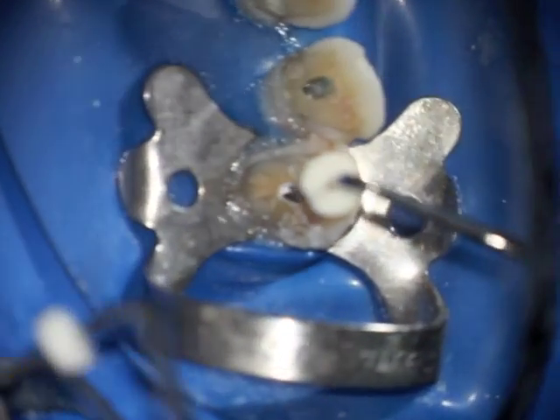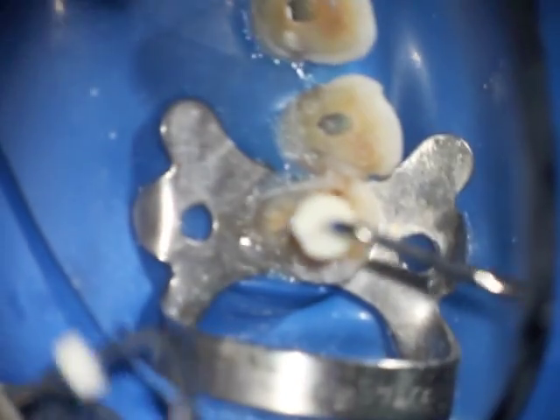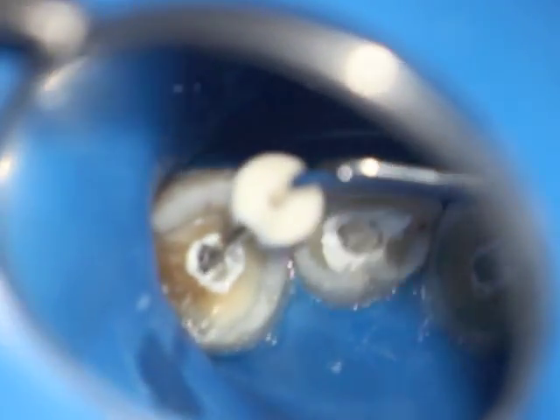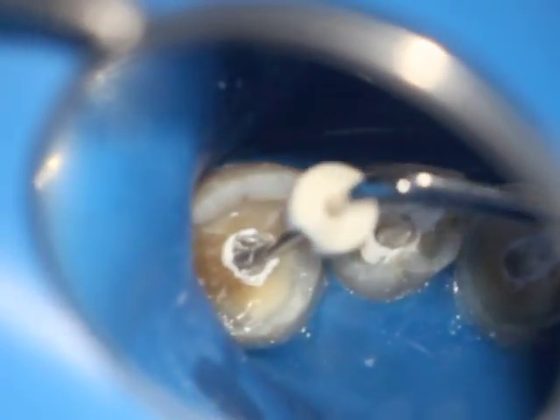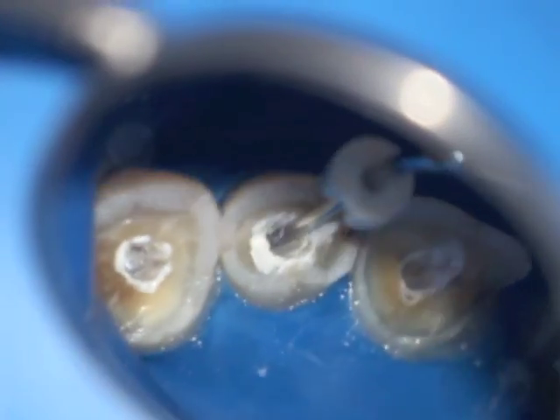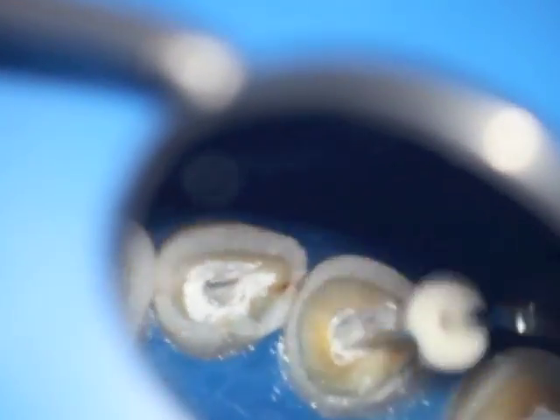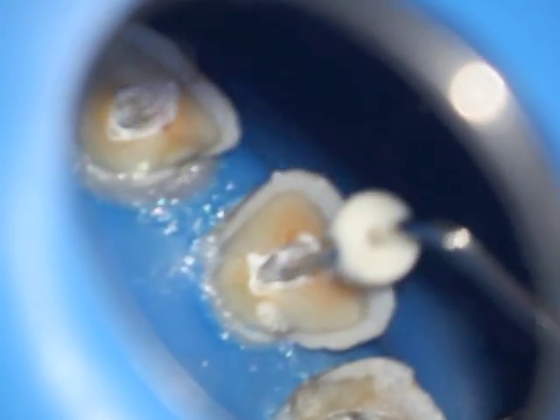This is really a byproduct of the current way of fitting the EndoSequence cone into the canal, and then having the ability to have the bioceramic sealer fill in the gaps. You can see now a small condenser is then used to condense the remaining segment a little bit more, but you can condense using the gutta-percha handle. It's important not to press too hard to avoid extrusion, and you would always avoid overextension of the cone by having a proper cone fit to begin with.